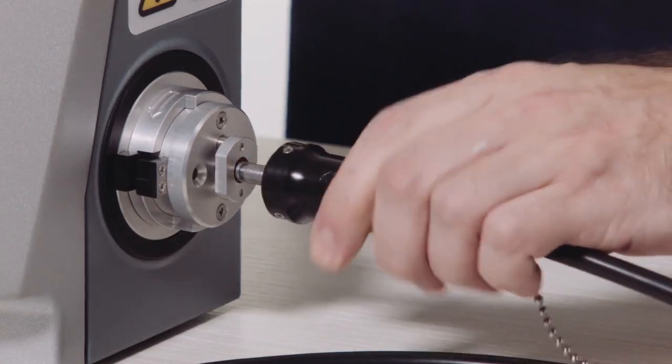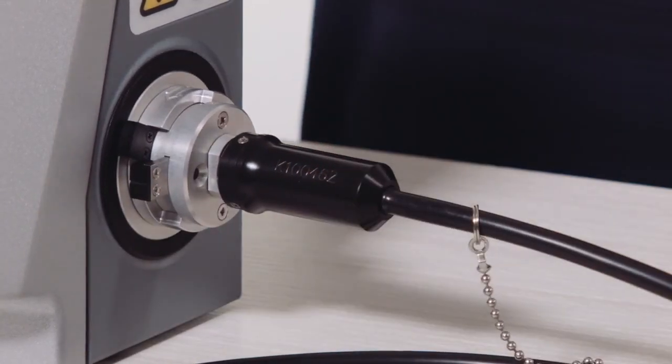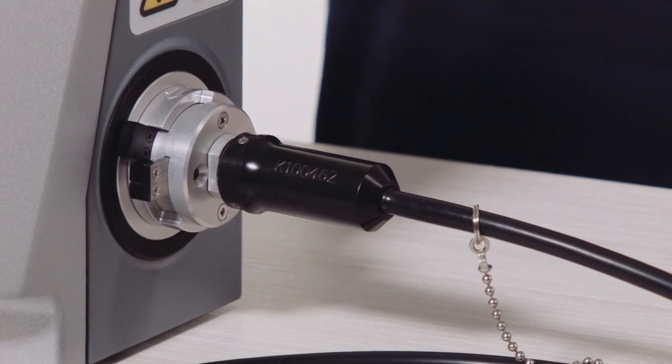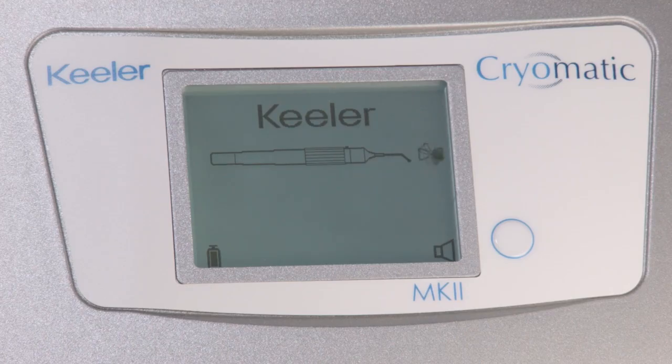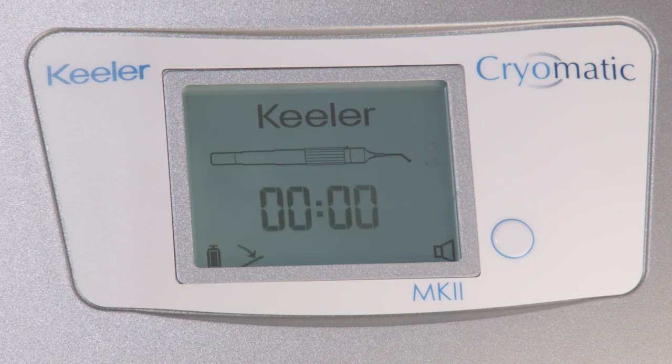Connect the cryo probe by aligning the coupling on the spigots and pushing to a positive click. The system will automatically initiate a 90-second purge cycle. Three short beeps signal that the purge cycle is complete. The equipment is now ready for use.